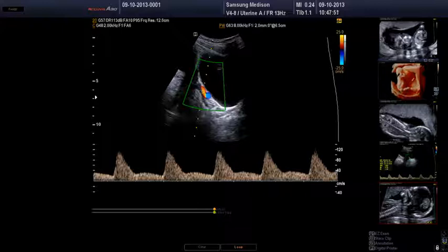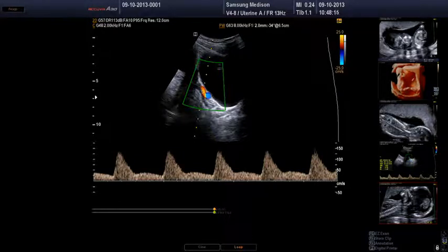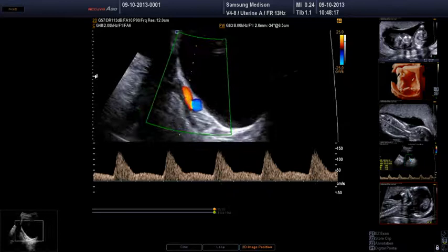So we'll just measure the PI on that. Are you angle correcting that, John, at any stage? I haven't really. The main parameter I'm interested in is the PI, which is a ratio, so I'm not so fussed about that. You could argue that you want to make sure that your PSV is over 60 centimetres per second, and there might be some benefit, therefore, in angle correcting from that perspective. But I did try and select a part of the waveform that was relatively vertical when I started.